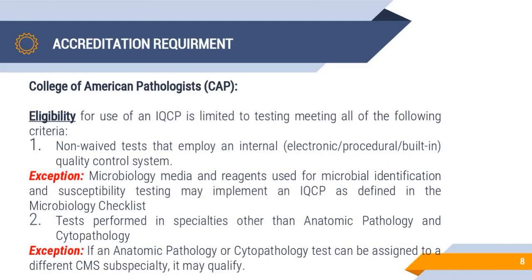So eligibility, who should do it? Non-waived tests, of course, that employ an internal electronic procedural built-in control. If your system has a built-in quality control, you have to treat it as a non-waived system. The exception is the microbiology media and reagents used for microbial identification and susceptibility testing, which may implement an IQCP as defined in the microbiology checklist. So the exception for non-waived testing is micro.